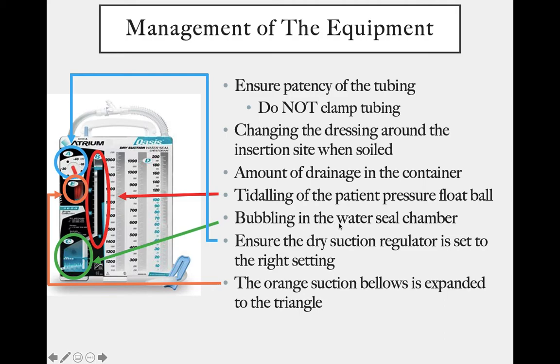We'll also be looking for bubbling in the water seal chamber. You'll see this if there's any sort of leak along the tubing or in the drainage canister. You may also see it if the patient has a pneumothorax.